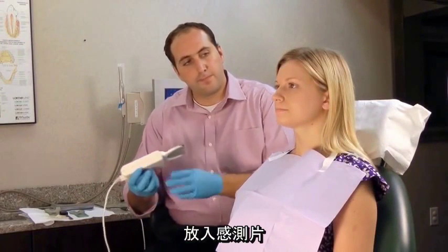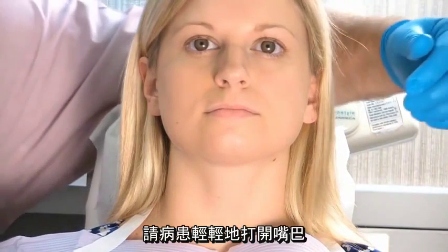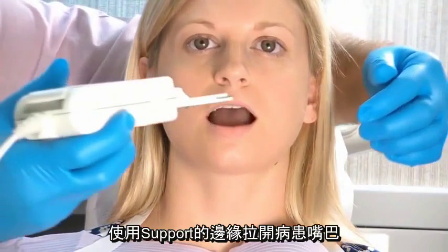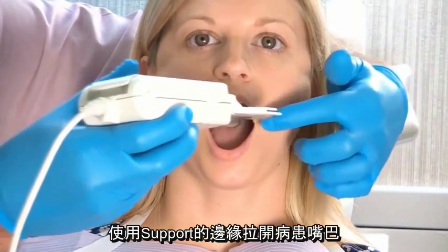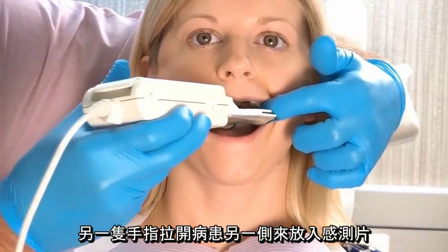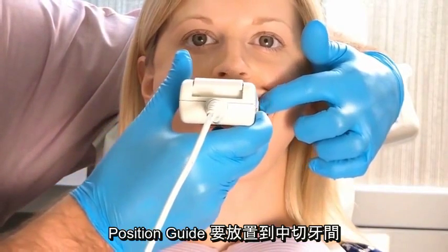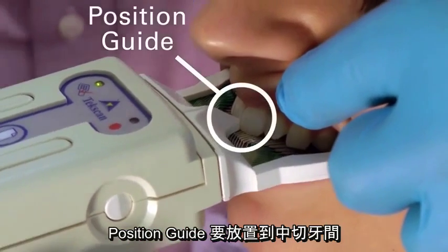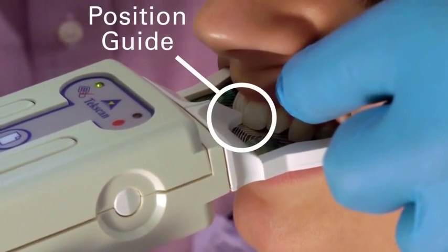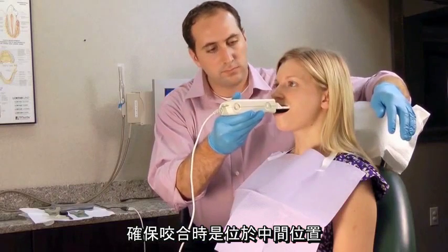Insert the sensor by rotating it into the mouth like that of an impression tray. Have the patient open their mouth slightly. Use the edge of the support to pull open the patient's cheek while pulling the opposite cheek open with your finger in order to elongate the mouth. Insert the sensor so that the position guide is touching the central incisors at the midline. Hold the sensor in place so that the sensor is level with the occlusal plane.